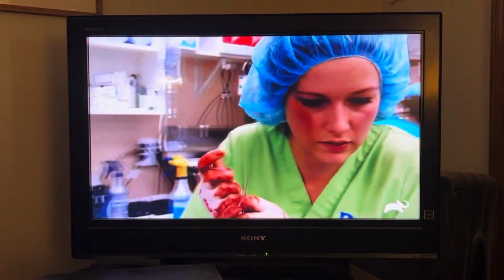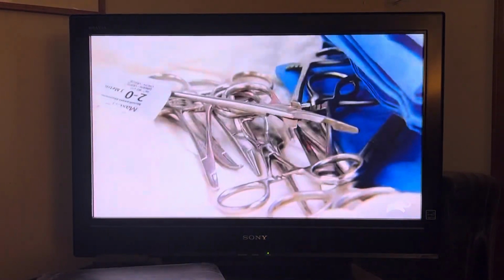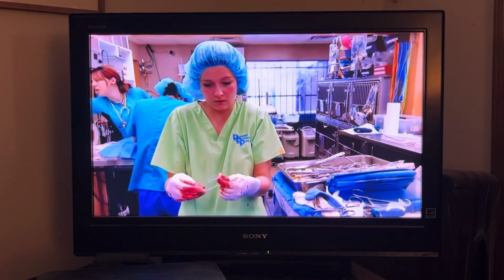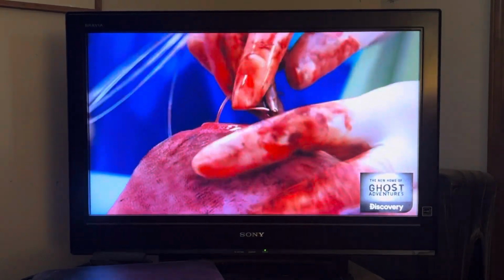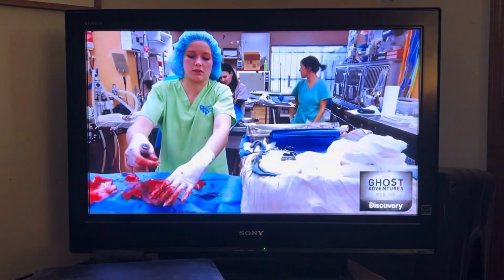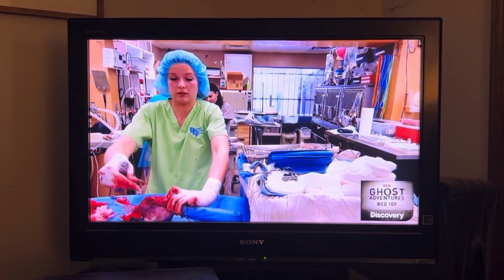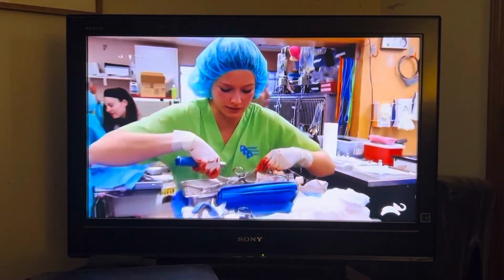Dr. Amy will insert a synthetic band to mimic what the ligament does inside the knee. So this is the band. It's just like a nylon wire. This top anchor here is above the knee. Now I'm going to make a hole in the bone below the knee to thread this through, and that will be the two spots that hold it in place.